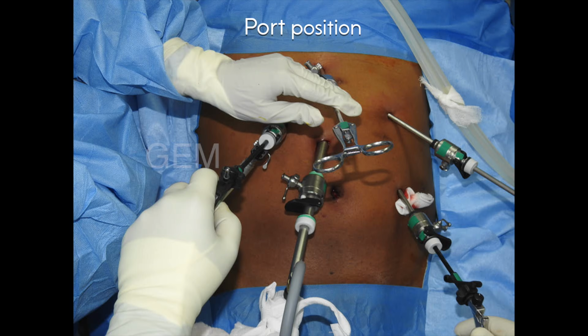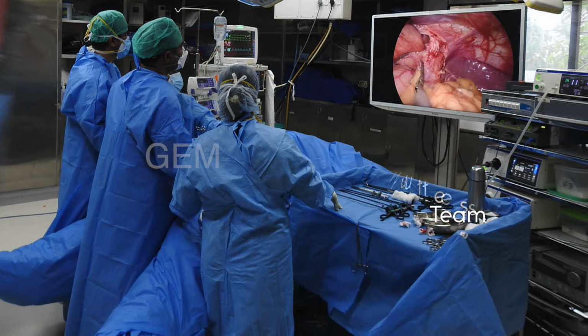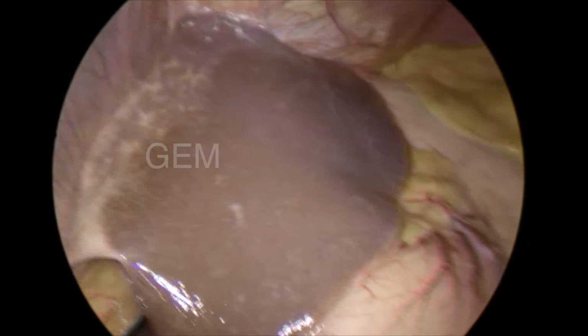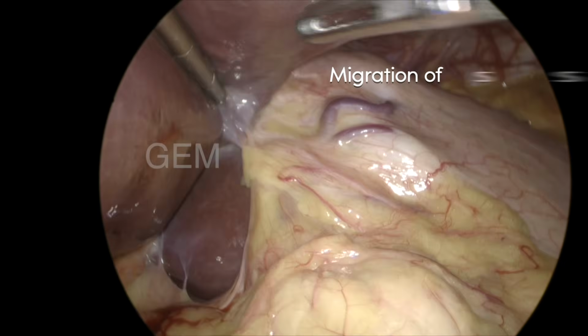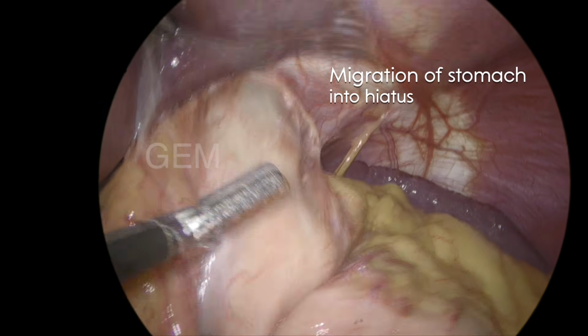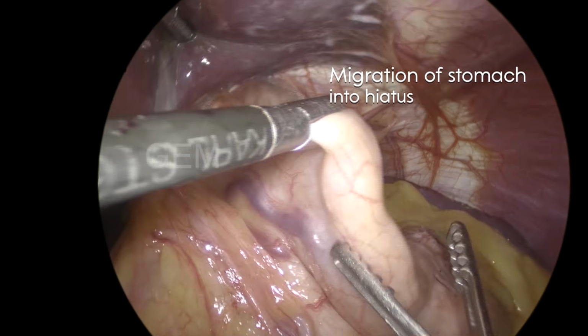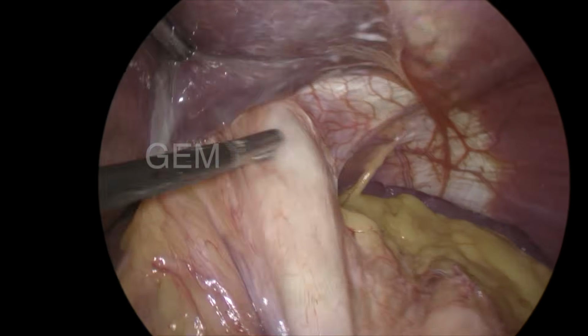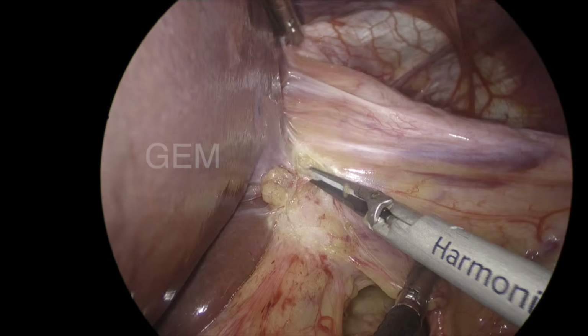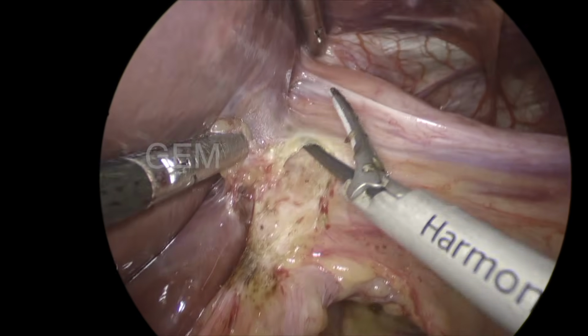So this is the standard 5 ports, one supraumbilical 10 mm camera port and 4 5 mm working ports. I stand between the legs, the monitor is at the head end of the patient, it's reverse Trendelenburg position, and my team. With the liver retracted through the epigastric port, the left lobe, you can see the migrated stomach into the hiatus. So this is the recurrence, one is dysphagia. Again, the patient had a hiatus hernia with the stomach as content.